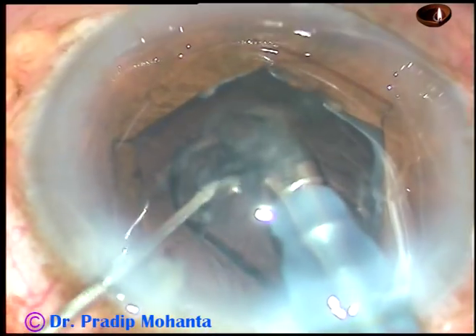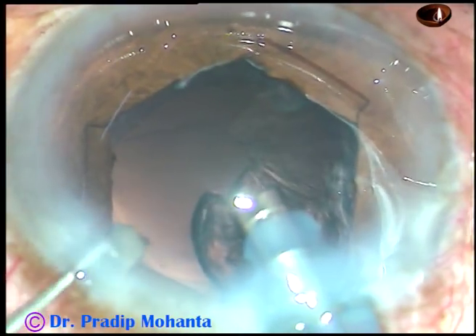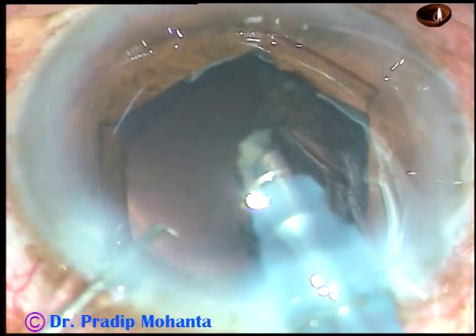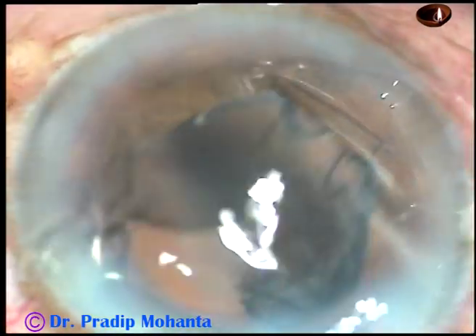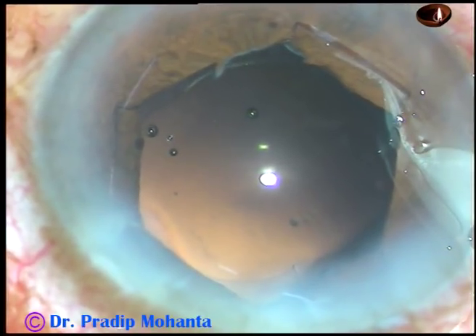The nucleus has been managed. This is a portion of the epinucleus and a small bit of nucleus remaining. It goes to the phaco tip and is emulsified. Then the phaco tip is removed from the anterior chamber.